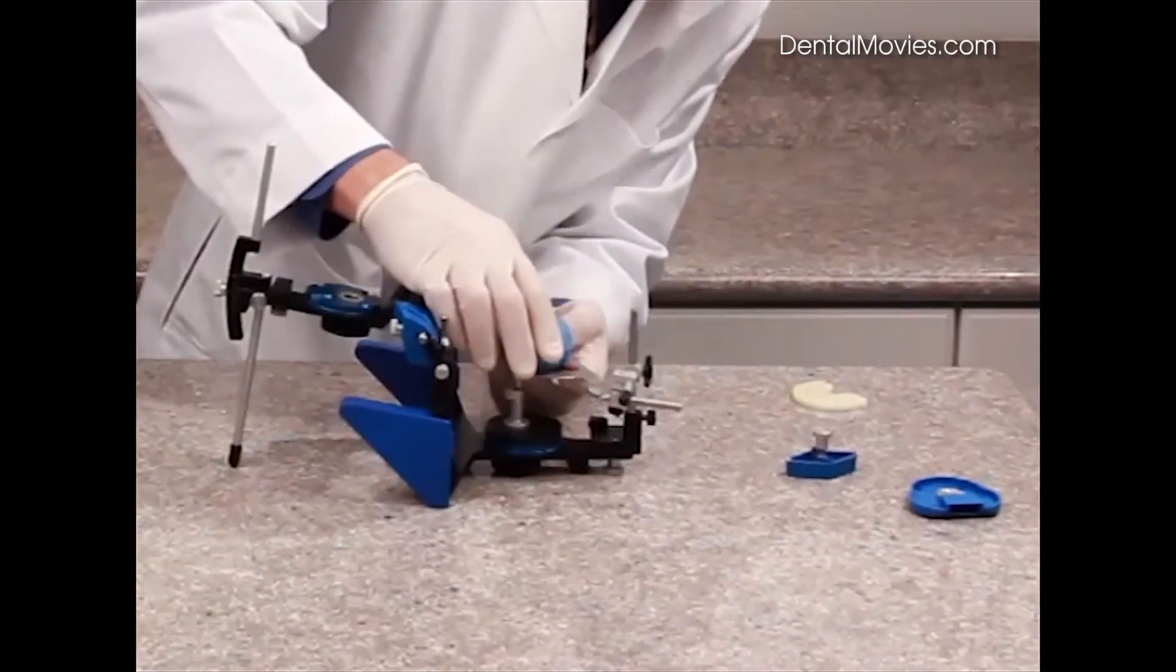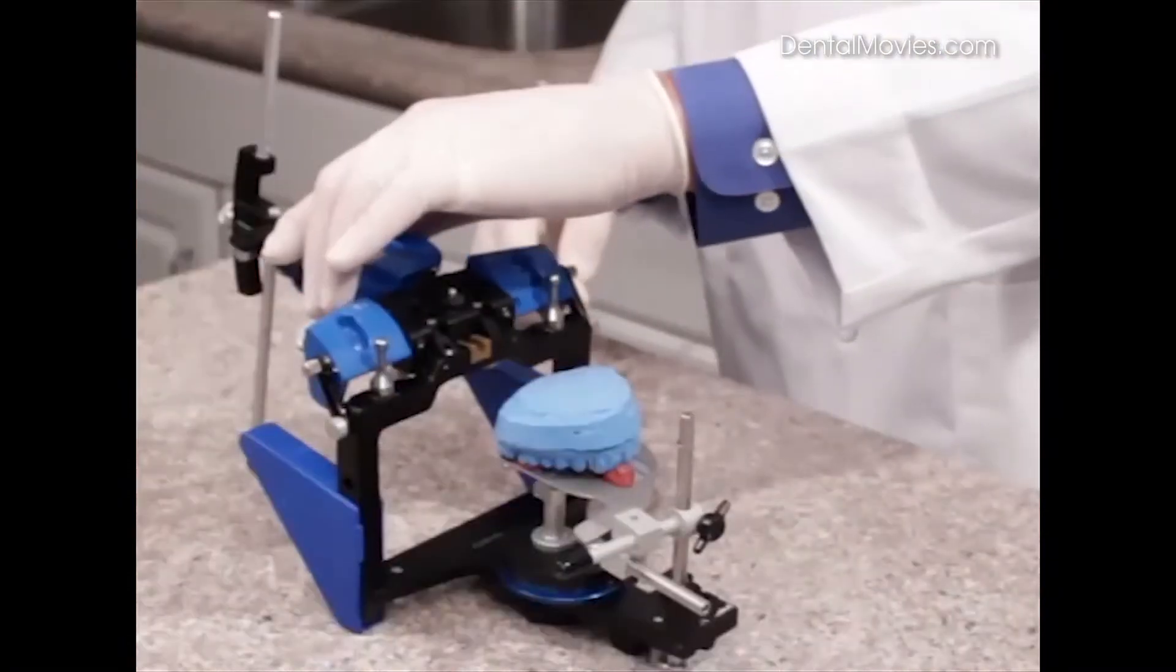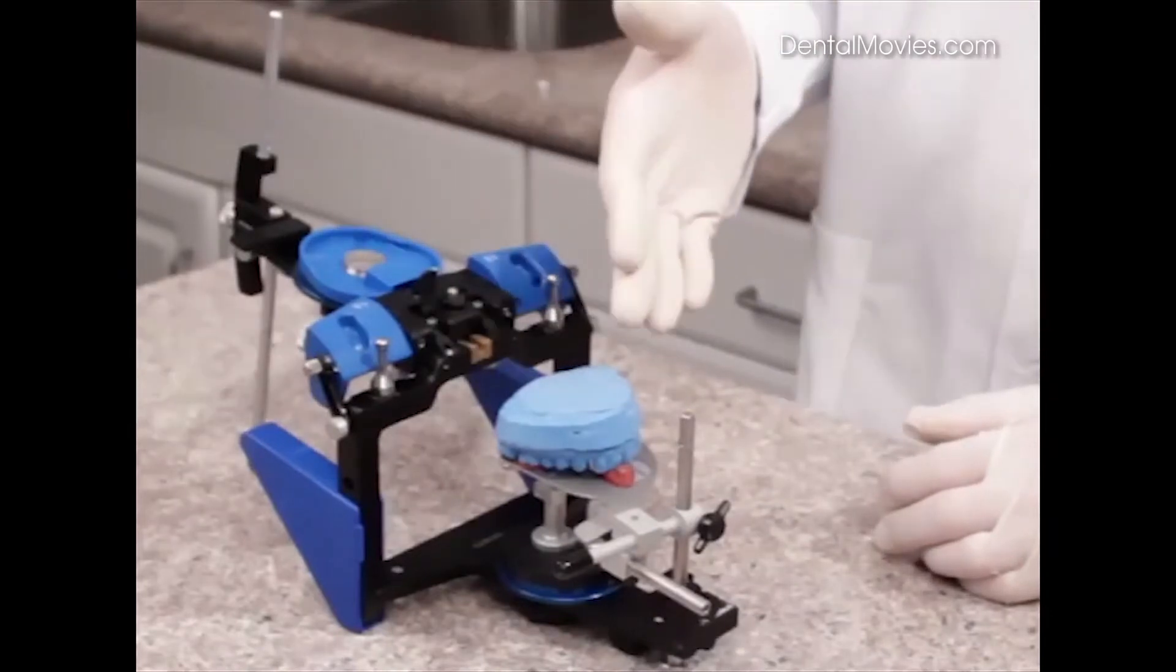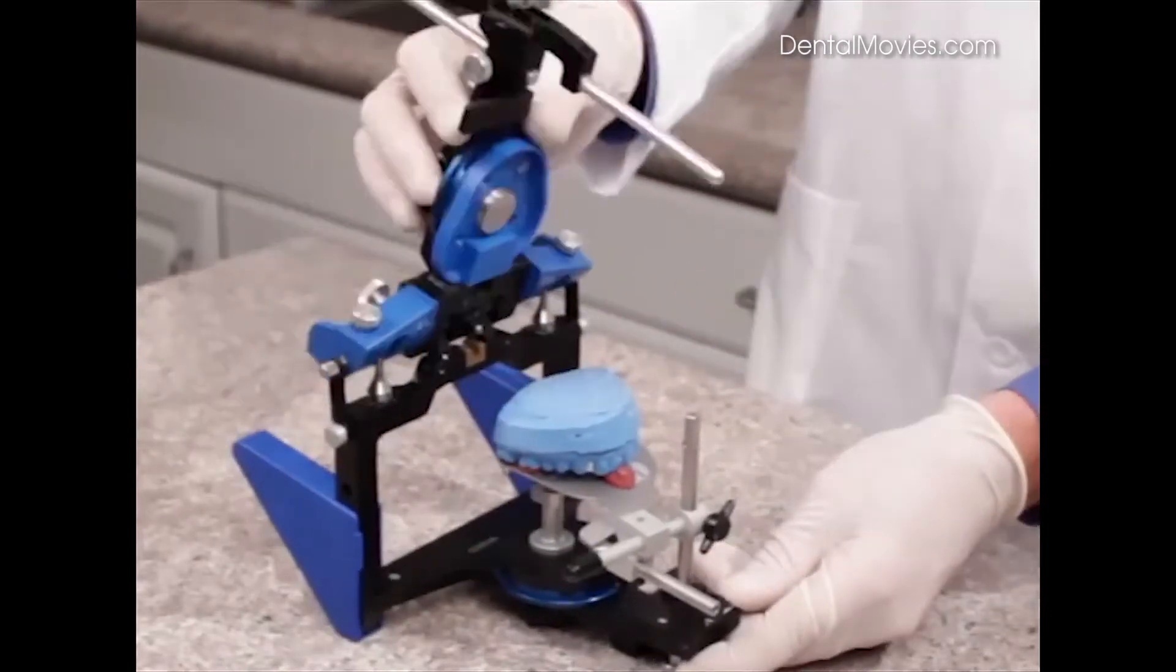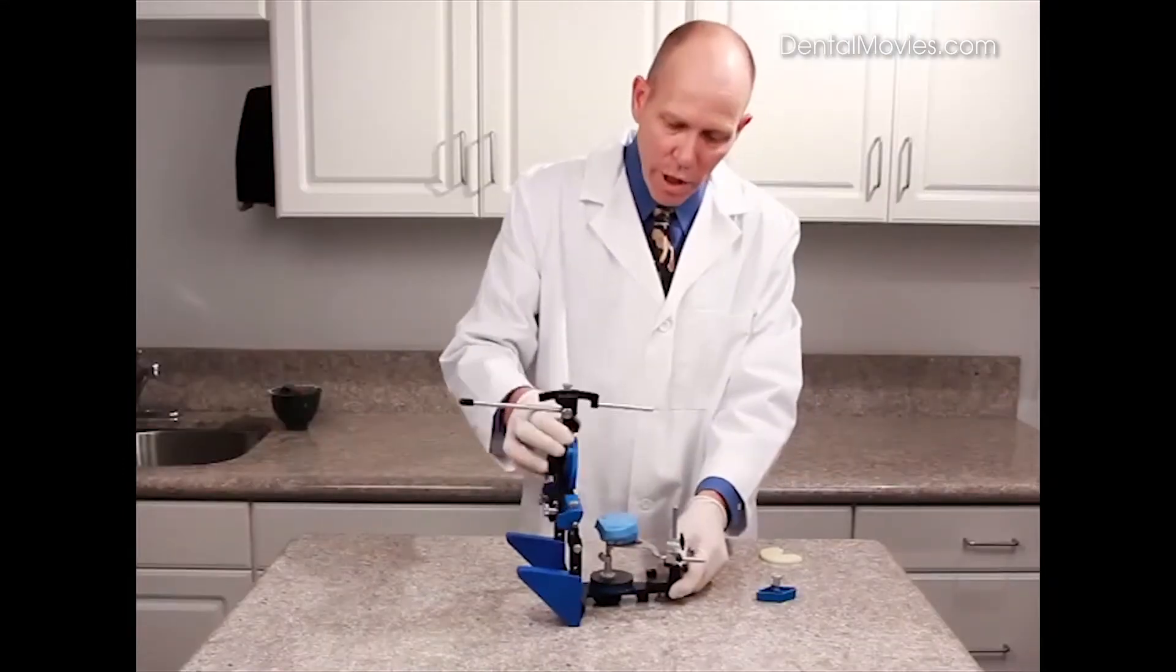We can now add our cast to the indentations on our bifork registration. We can add a mounting plate to the upper frame. We can mix plaster at this time and add to the mounting plate and to the cast, making a connection of the upper cast to the upper frame of the articulator.